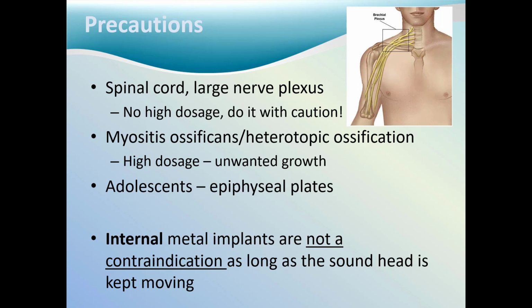We need to be cautious for myositis ossificans or heterotopic ossification. With the wrong parameters or a high-dose treatment, such as thermal treatment, we may result in unwanted growth of that area. We also need to be very cautious in treating adolescents, as ultrasound may affect the epiphyseal plate and could cause premature growth plate closure. Internal metal implants are not a contraindication as long as the sound head is kept moving.